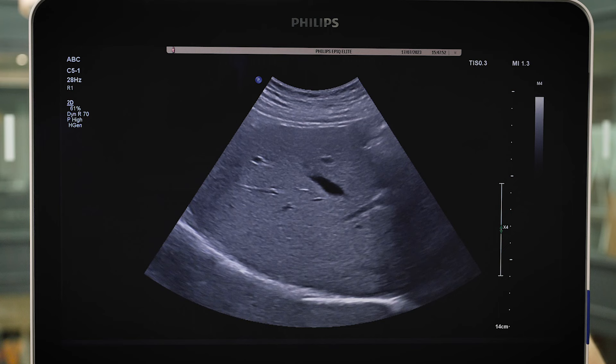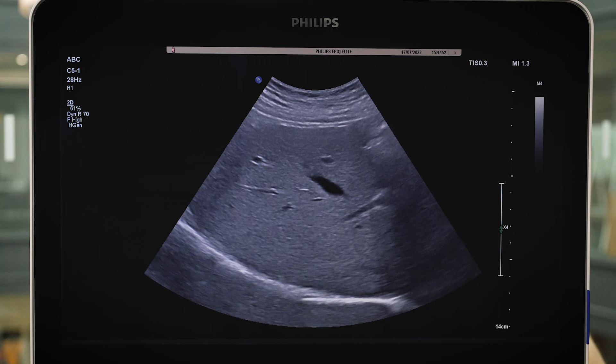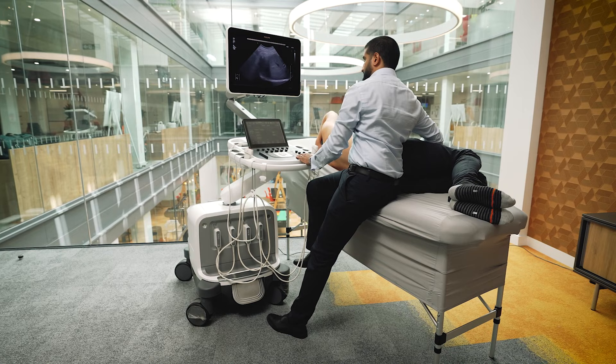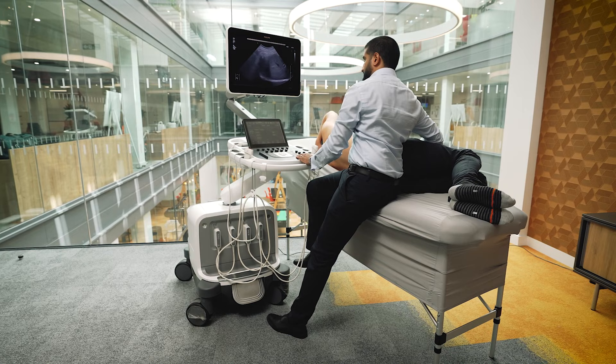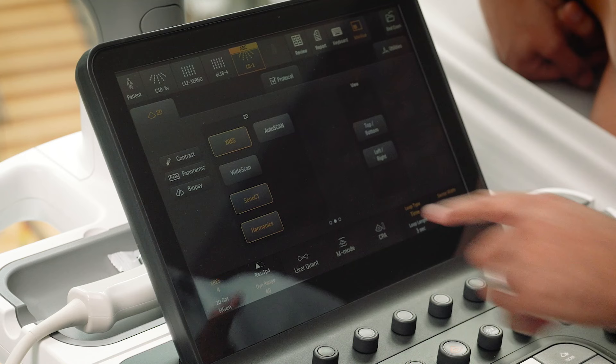Tissue harmonics increases the lateral and axial resolution over the 2D image. It is used to reduce artifacts such as reverberation and side lobe artifacts, and is mainly used to clear vessels and other fluid structures. This can be turned on and off using the touch screen.